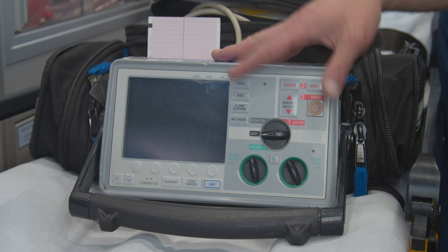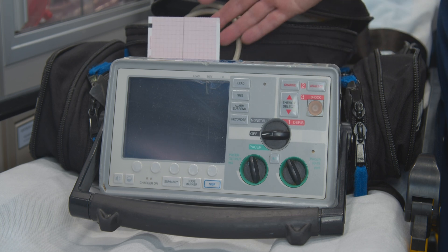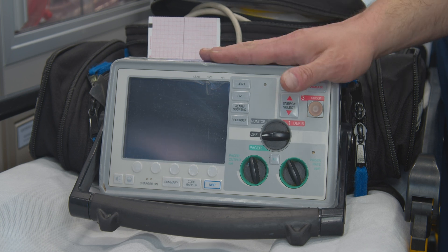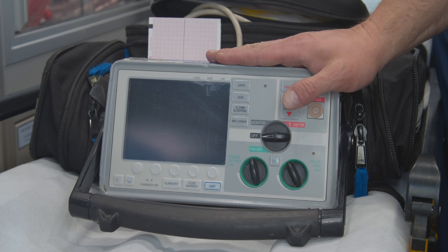If you have a more critical patient and you want to show some more strips, feel free to grab more and just make sure that you're taking photos of them and including them with your documentation. That's it on the Zoll E-Series. Thank you.